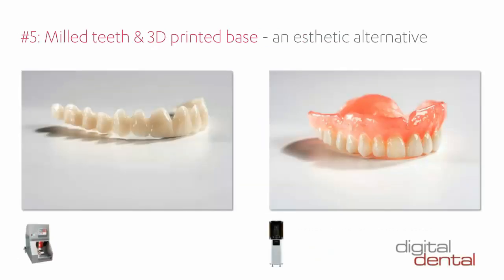There's a question about how to polish the denture base and printed teeth. I will say we have to be fair. We are not into all the different polishing techniques here. But I believe that the polishing is a standard polishing that you use. But I know, for instance, that Formlabs have released, and you can find it on their homepage, a full guide on how to do this.